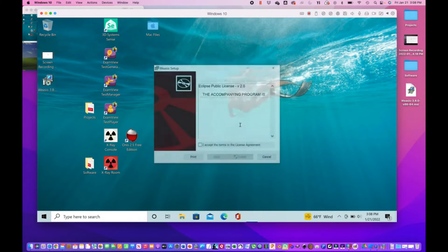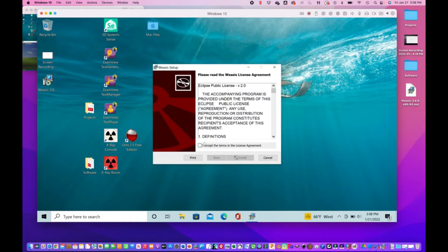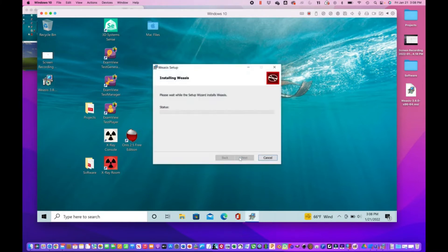Just follow the prompts for installing, accept, install.